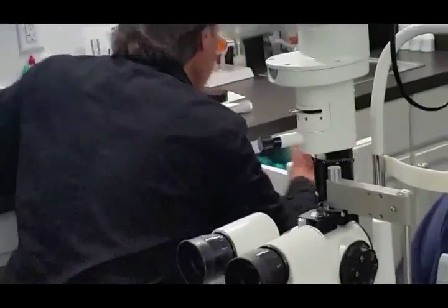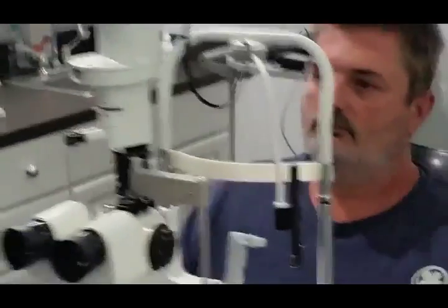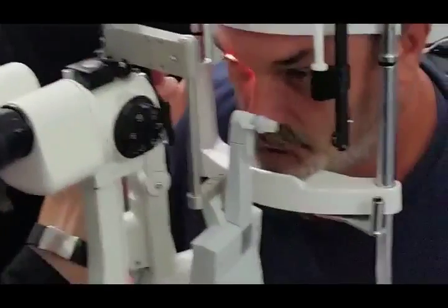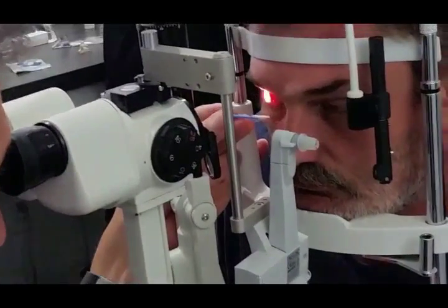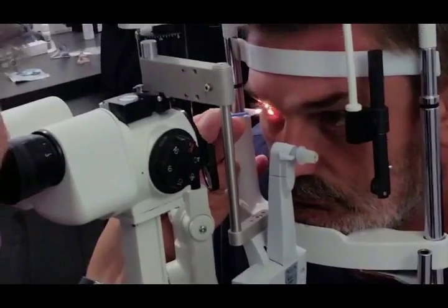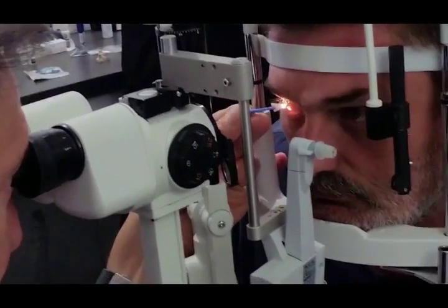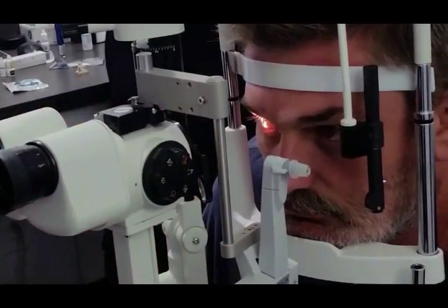Here we've used an Alger brush to debride his central cornea. We use Tetracaine to anesthetize the eye — we find it provides slightly deeper anesthesia — and we're now going to remove the extra loose epithelium to prepare his cornea for the graft.